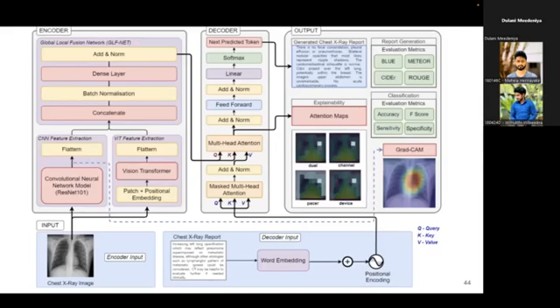image. The reason for using both CNN and vision transformer is CNNs are better for their ability to capture local features in an image. With the help of convolution layers, CNNs excel at detecting patterns, edges, textures, and local structures within an image.